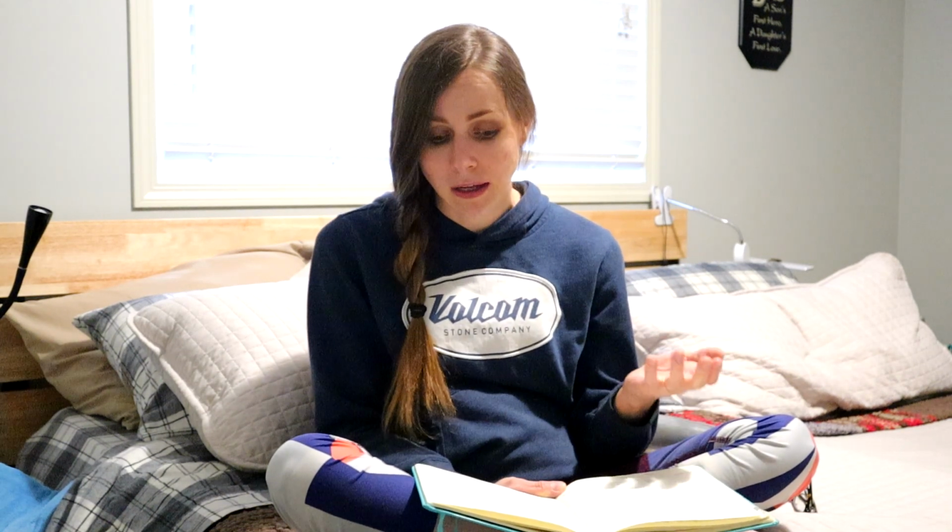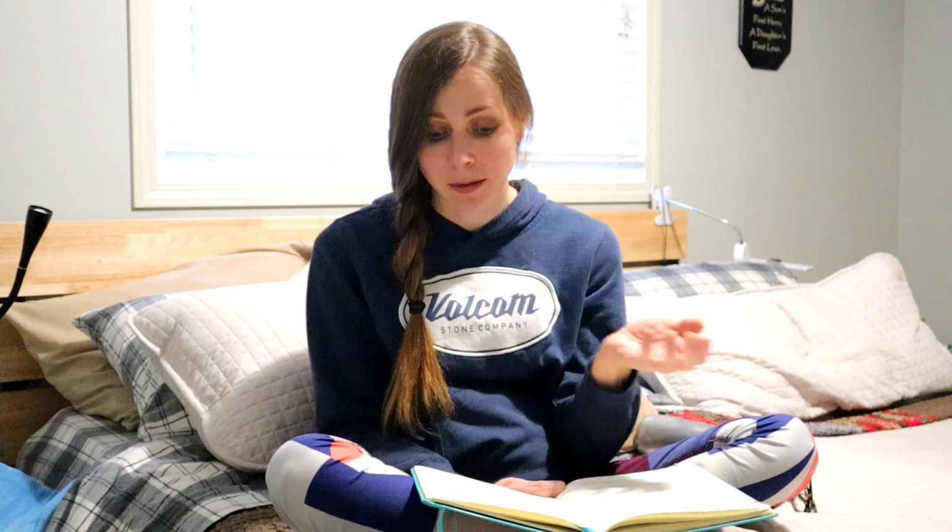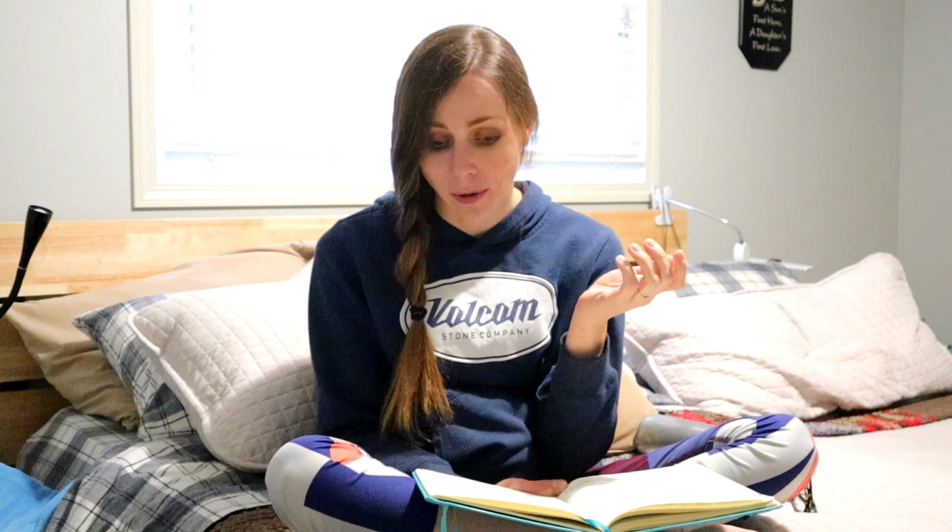Another benefit of it is it lowers the risk of UTI, just like the suprapubic catheter does, because you're avoiding the bacteria in the perineal area. For anybody that doesn't know what the perineal is, that's like in between your vagina and your anus. So it's like a highway for bacteria to travel from your anus to your urethra, and so you're just avoiding that altogether because the catheter is not going in that area.